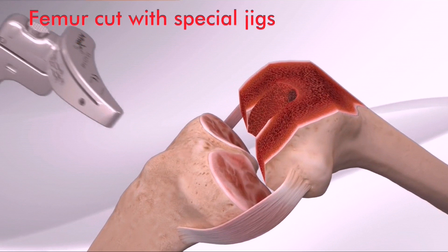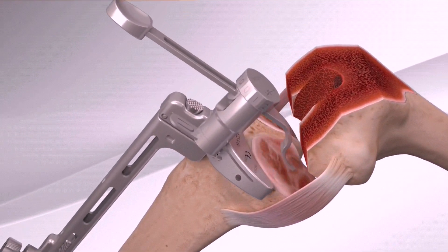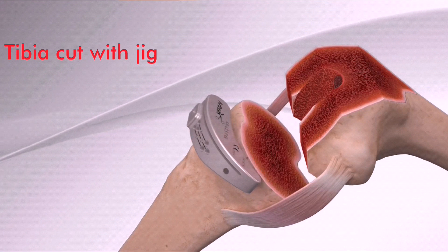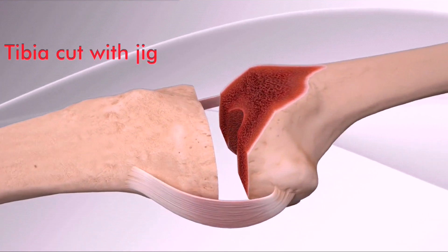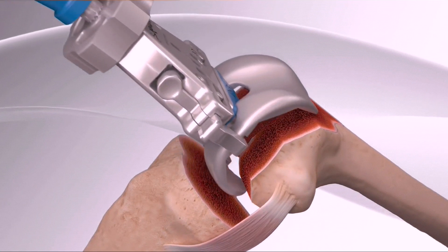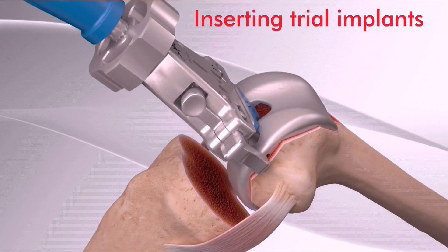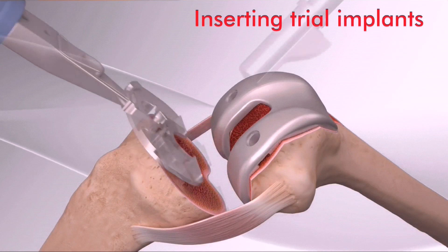Next, your doctor will prepare the tibia using a series of guides to ensure proper implant size and alignment. The final tibia preparation is completed and a trial spacer is used to confirm knee stability.